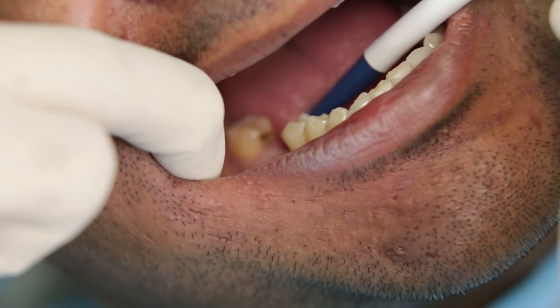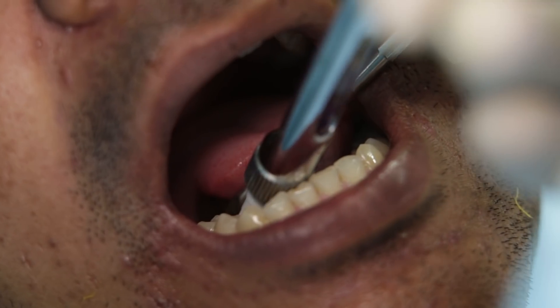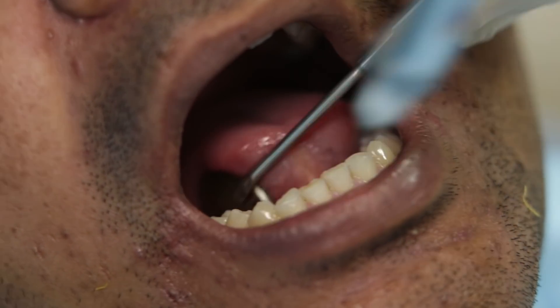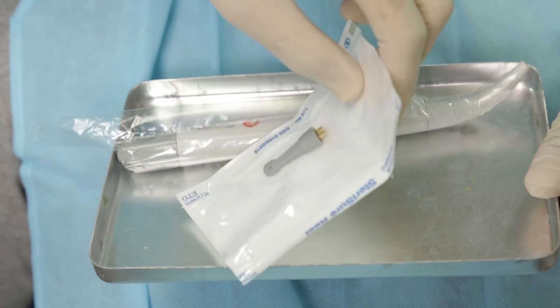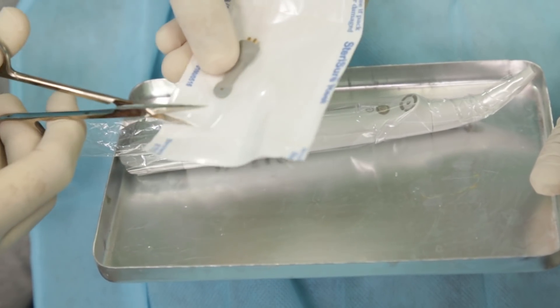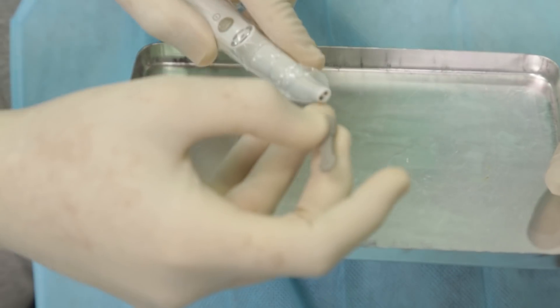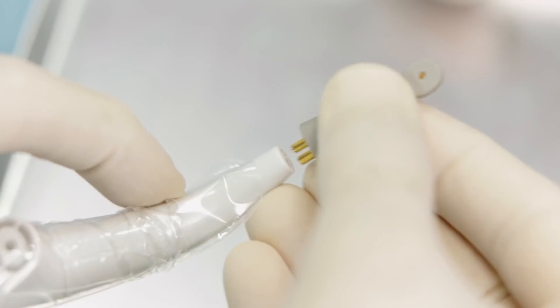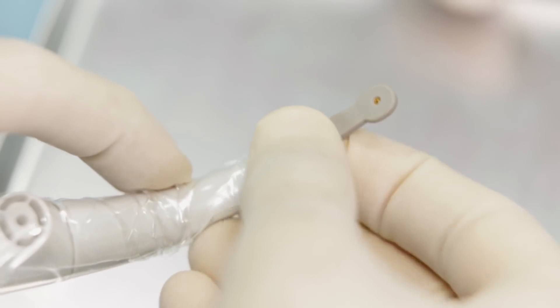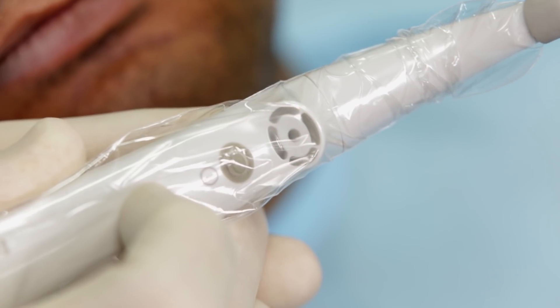In this case, instead of raising a flap, I shall use the implant locator. I have already scrubbed my patient with betadine and I am now going to use some local infiltration to numb the patient. I had the sensor tip already autoclaved in a sterilization pouch — I will just retrieve it and place it on the sensor holder. I will put on the implant locator and you can see that it's calibrating itself.